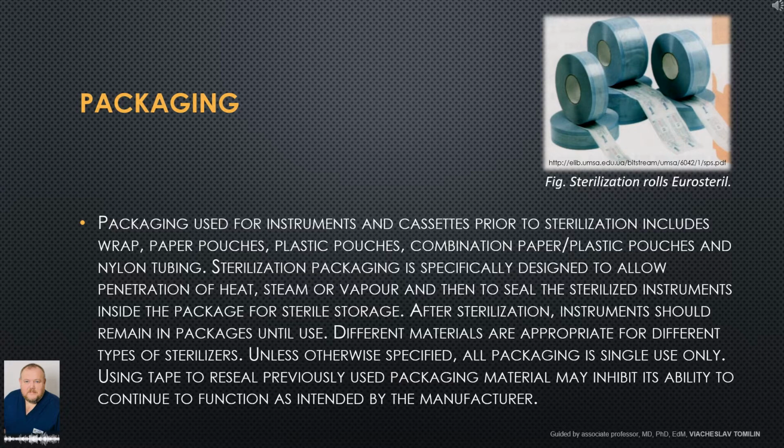Different materials are appropriate for different types of sterilizers. Unless otherwise specified, all packaging is single-use only. Using tape to reseal previously used packaging material may inhibit its ability to continue to function as intended by the manufacturer.